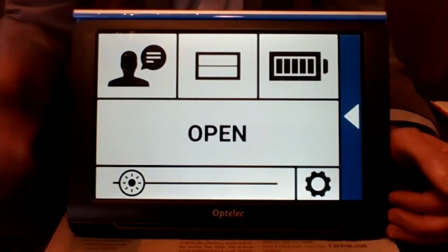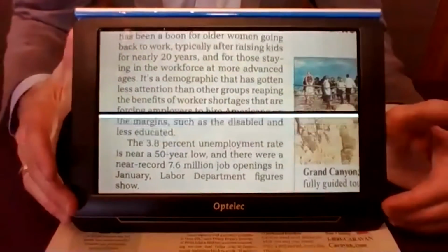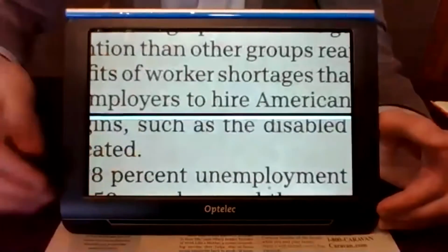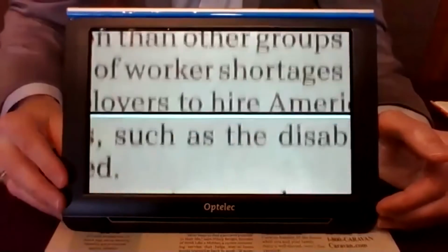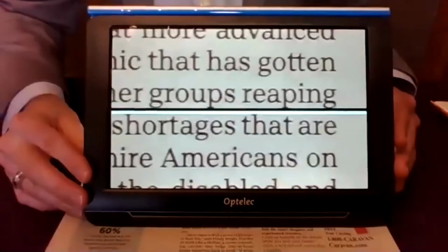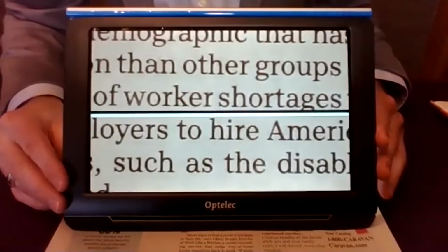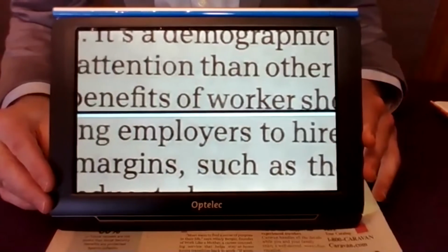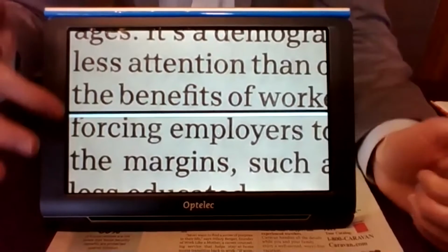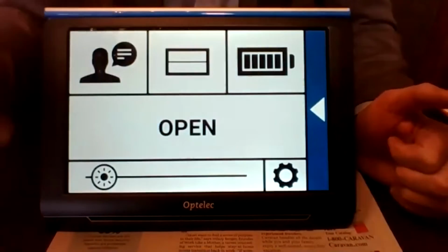The reading line, top middle. I was talking about navigating documentation, which can be difficult. So having something that can help. If you magnify that a little, Mike, yeah. I mentioned earlier about this format using the camera. You'd be moving that camera above your reading material. And if you're in a high level of magnification, or if there's a lot of text, it can be difficult to navigate one line of text to the next. So having a navigation line, or a reading line, as we call it, is another one of those ways to reduce the barriers.